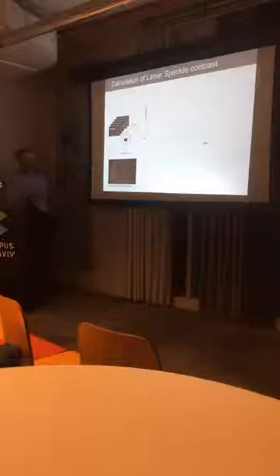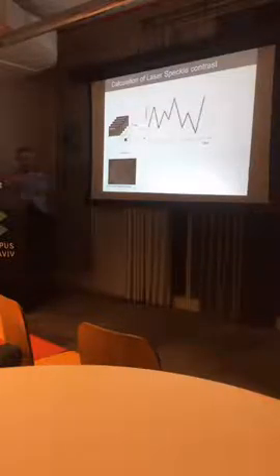Let's say we illuminate the mouse with the laser, then we collect the images, and after that we can take one single pixel over time and analyze the statistics. What happens with the light intensity over time? Simple and easy. So this is the time intensity, and this intensity changes over time.